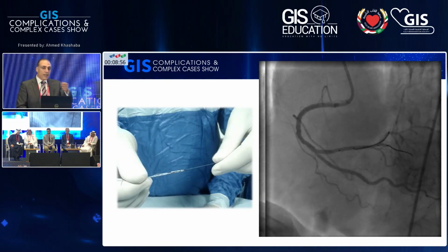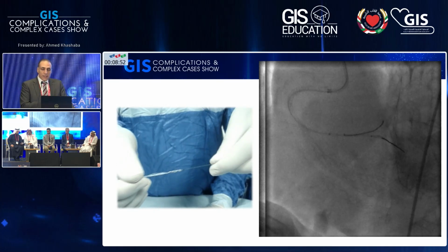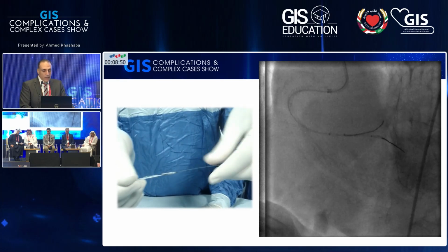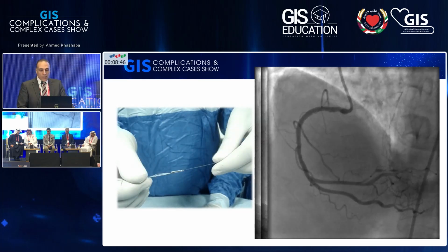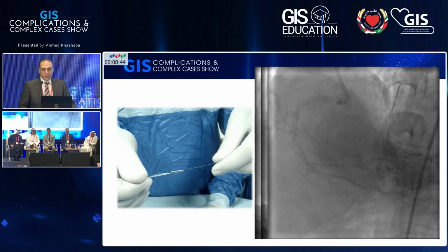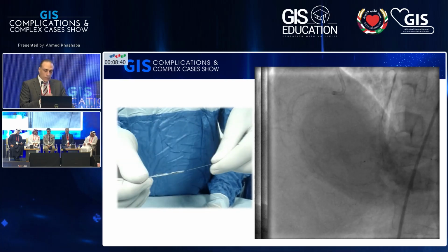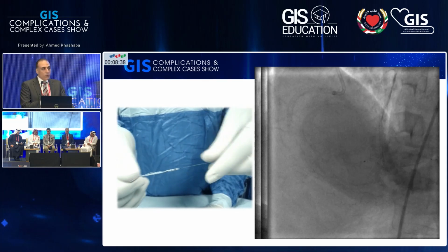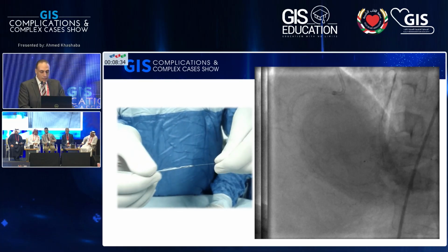At the crux, I had some difficulty, so I used a buddy wire to facilitate the passage. And with the usage of a buddy wire, it could be introduced to this very small branch. And this is after removing. You still have very minimal flow. And of course, till that time, we didn't reverse heparin, but at that time, we started to reverse heparin and leave it for that.